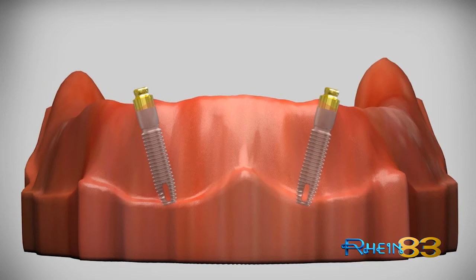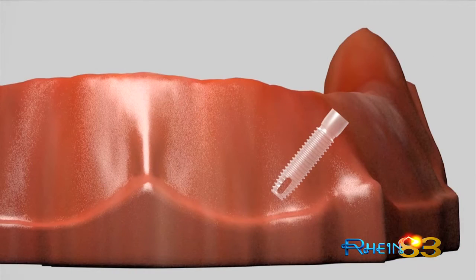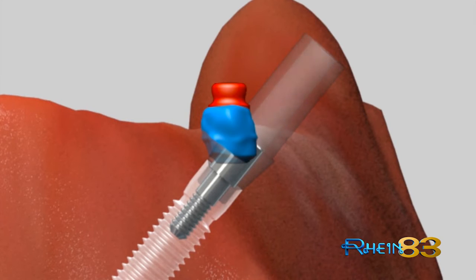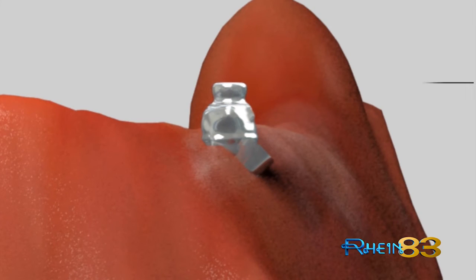In excess of these divergence degrees, the optimal solution is the castable Equator. When used, connected to the UCLA of the implant system, it allows the technician to correct any kind of divergence, achieving the desired direction, providing the aesthetic result and passive insertion of the prosthesis.